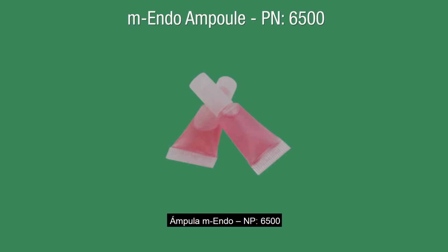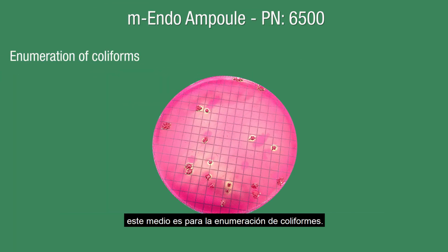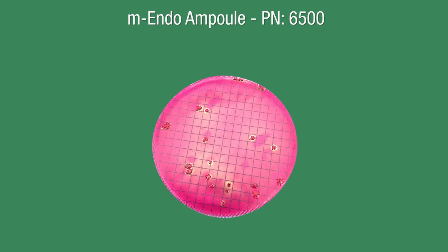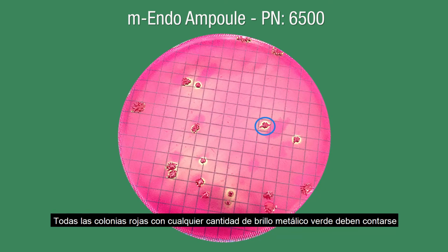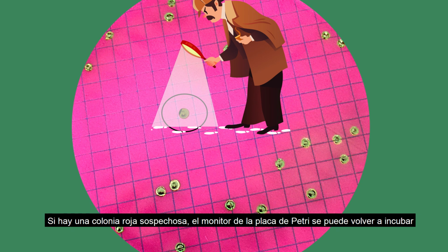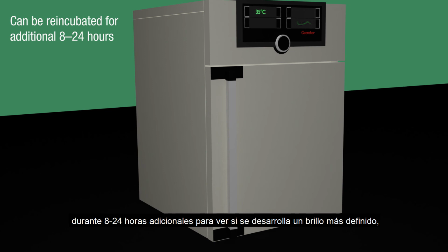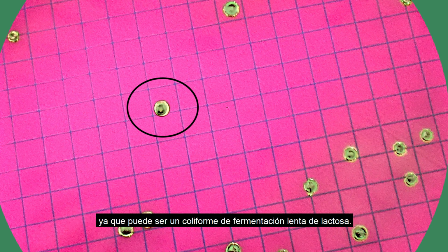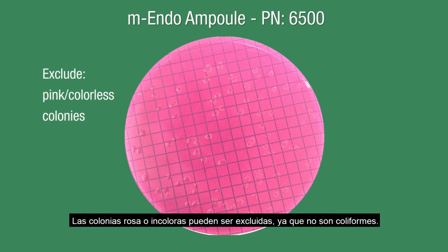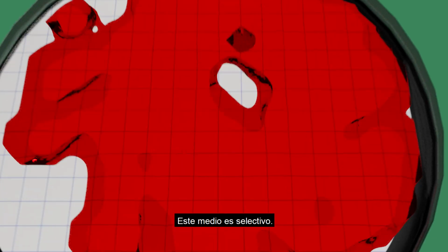M-Endo ampule. Recommended by APHA and US EPA, this media is for the enumeration of coliforms. All red colonies with any amount of green metallic sheen should be counted and recorded as positive for coliforms. If there is a suspect red colony, the Petri dish monitor can be re-incubated for an additional 8 to 24 hours to see if a more defined sheen develops, as it may be a slow lactose fermenting coliform. Pink or colorless colonies can be excluded as they are not coliforms. This media is selective.